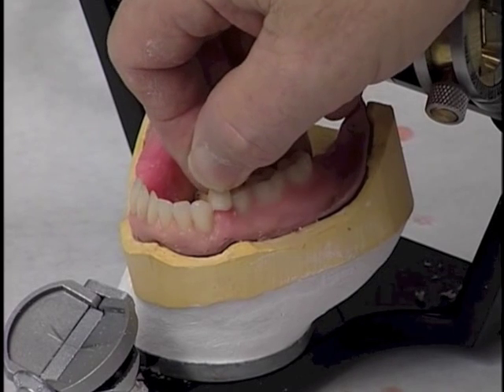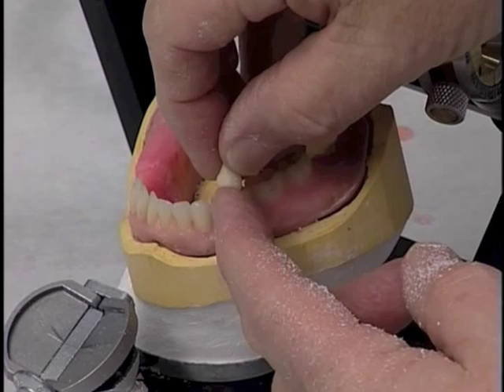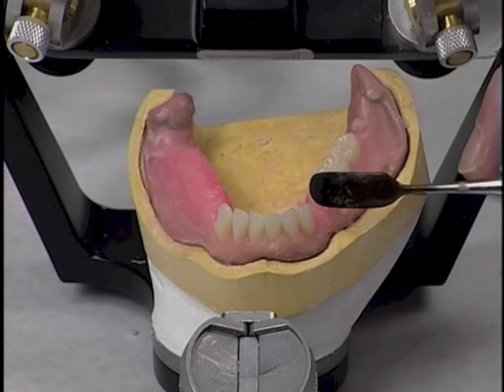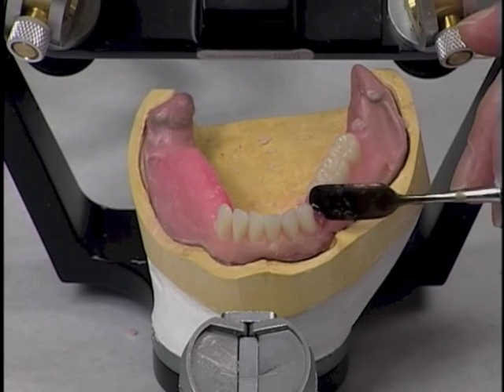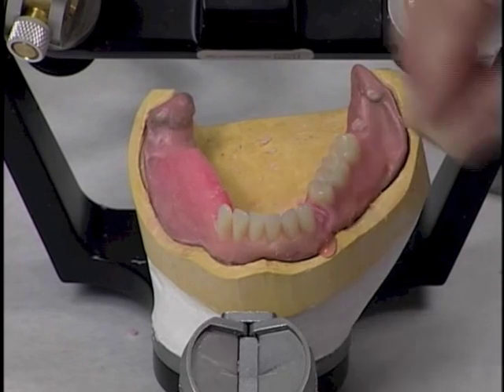Now it appears as though that tooth will fit the space okay, by hollow grinding it on both the mesial and the distal of the tooth. Arrange this first premolar in such a way that it will be of good aesthetic value. We don't end up with it looking too crowded or looking as though there are spaces there.